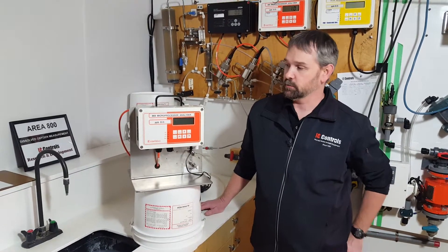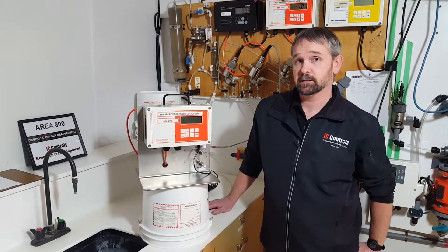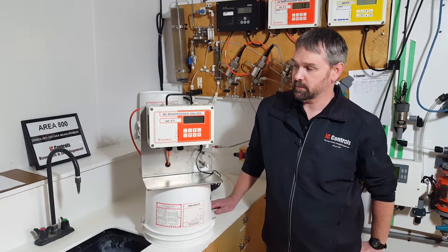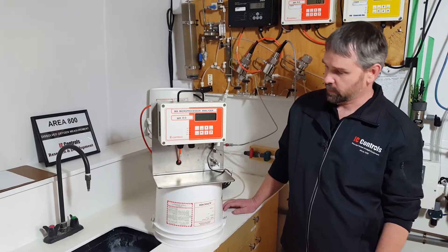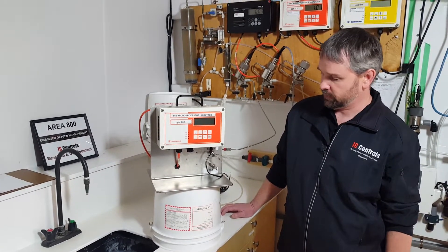Welcome to IC Control's basic overview of the model 869-22 PPB Dissolved Oxygen Analyzer. What we're going to do is just go over a basic overview of what's what and how the flow works.